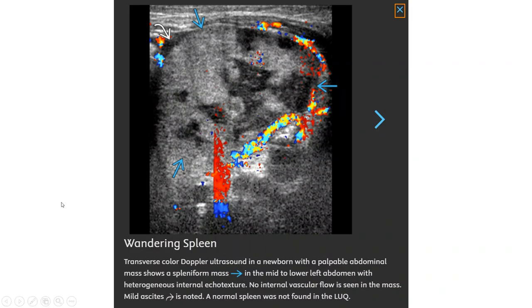This is an ultrasound image showing a mass in the mid lower left abdomen with heterogeneous internal echotexture. No internal vascular flow is seen in the mass. Mild ascites is noted, and a normal spleen was not found in the left upper quadrant.